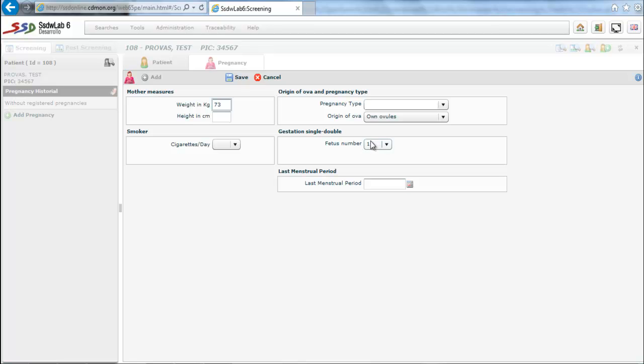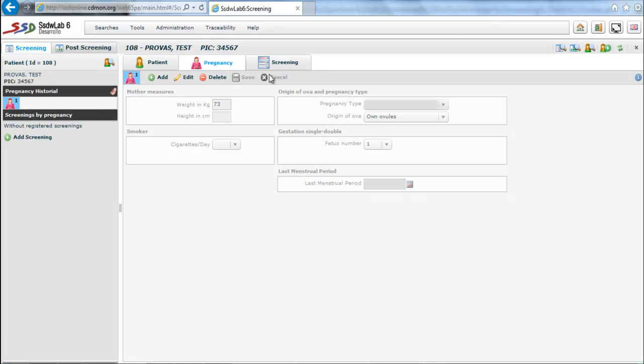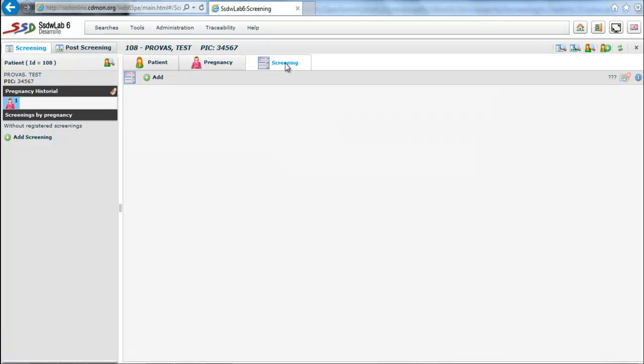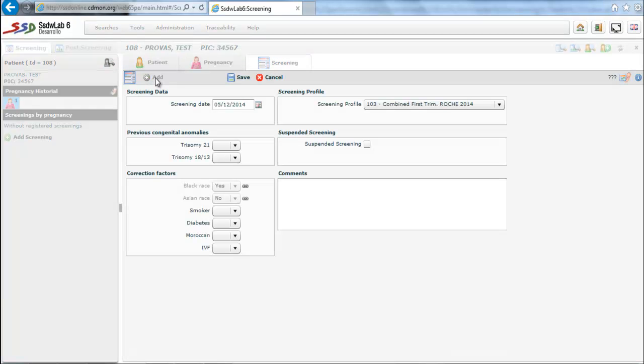The next is the screening folder. We must enter the data screening, that is the date of blood sample extraction. We also introduce the screening profile.